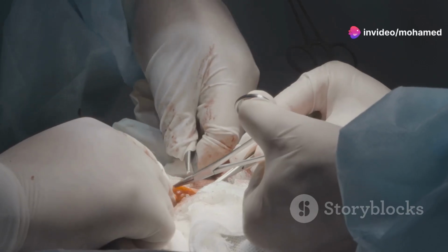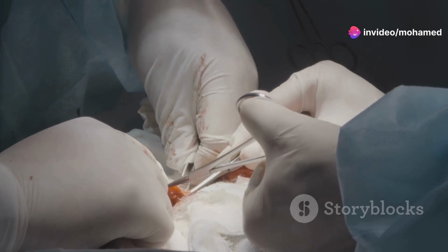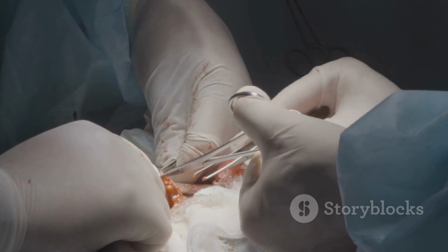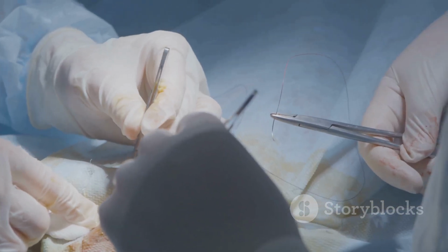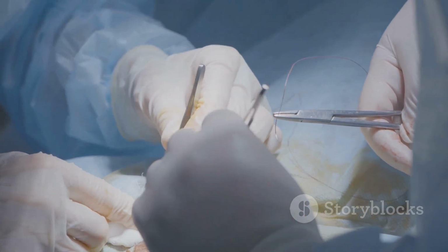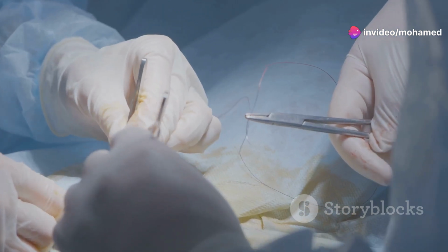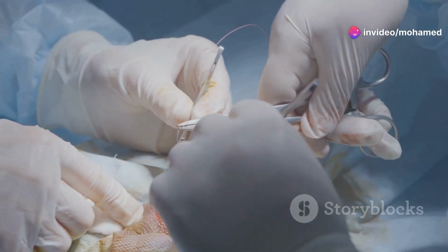They're great for internal tissues because you don't need to remove them later. This is particularly beneficial in surgeries where accessing the sutures again would be difficult or risky. You'll often see these used in gastrointestinal or gynecological surgeries. These areas benefit from the reduced need for follow-up procedures and the minimized risk of infection.